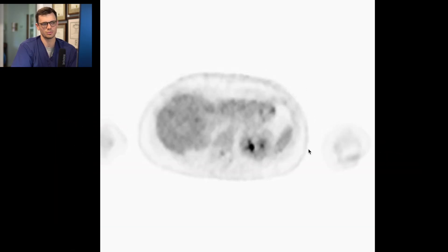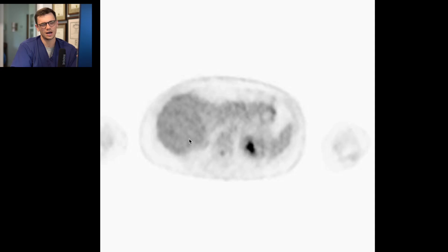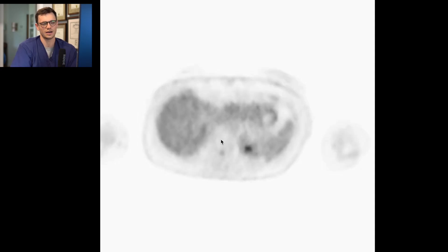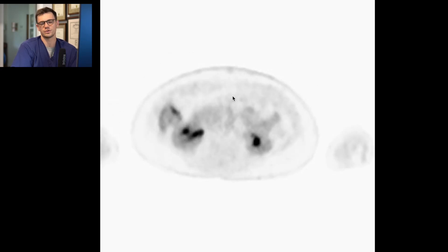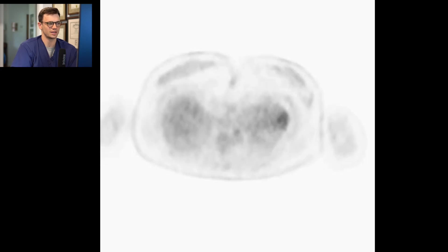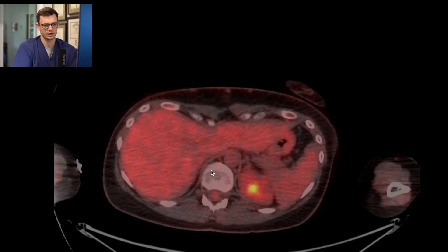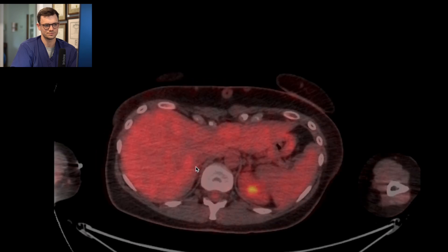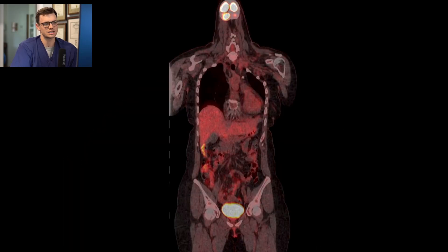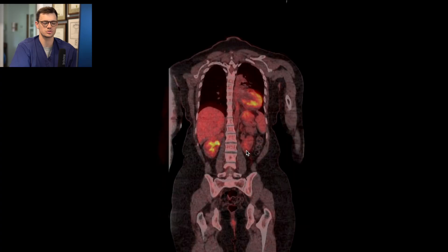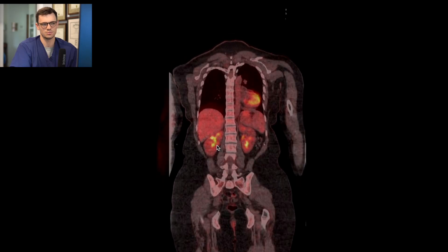I actually pull up the PET images alone because I think it's better for looking at the liver. The liver often shows heterogeneous distribution of tracer — you can see areas that look kind of hot but aren't metastases, and it can be a little tricky. You're looking for anything definite, anything that's much hotter than the background liver. Going through the liver now and I don't see that. I then go back to the fused images and go through every organ: the liver, the spleen, trying to catch the adrenal glands, the pancreas — that all looks normal. Then look at the kidneys. I recommend getting a coronal reformat to look at the kidneys because tumors of the kidneys can be very subtle on axial images. The kidneys are normal here. Remember the kidneys excrete tracer, so you see bright stuff centrally within the kidneys in the collecting system.